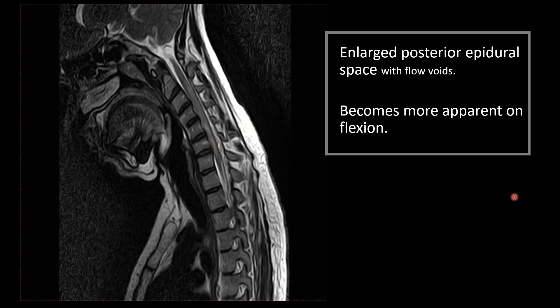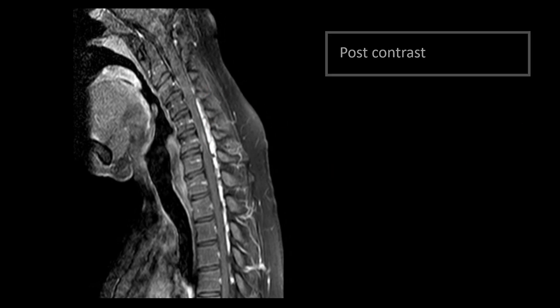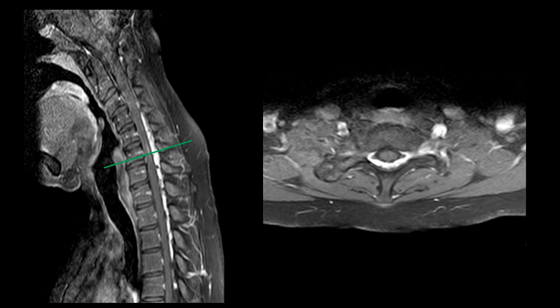This posterior epidural space enhances on contrast. You can see this homogenous post-contrast enhancement along the posterior epidural space which is causing compression of the cervical cord in flexion. On the axial sequence at this level, we see the homogenously enhancing posterior epidural space and anterior shift of the spinal cord.